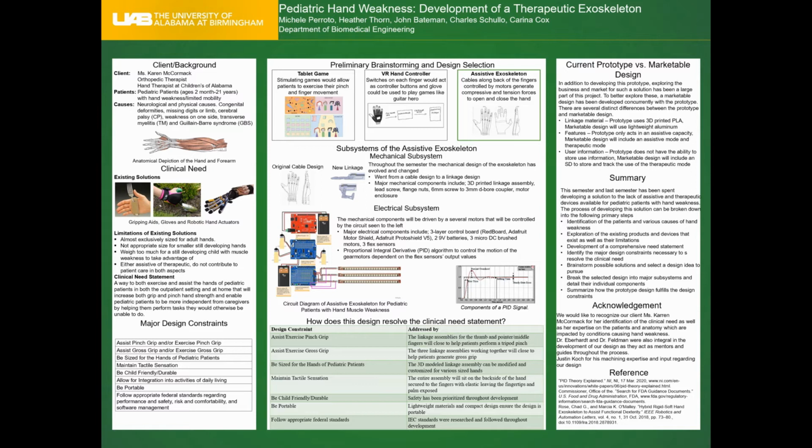The mechanical components will be driven by several motors that will be controlled by the circuit seen on the left. We plan to use a proportional integral derivative algorithm to control the motion of the gear motors dependent on the flex sensor's output values. Using a PID algorithm greatly increases the accuracy of the movement.